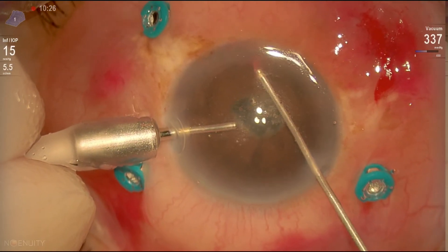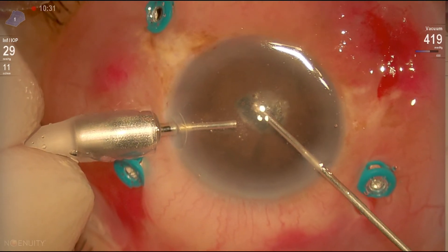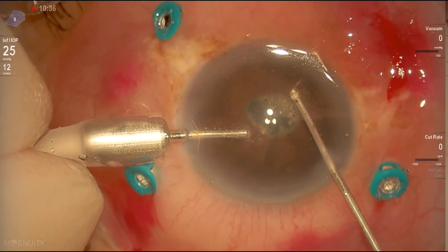Here, further cleaning of the anterior chamber with the vitreous cutter — there's some blood as well — just to get a better view.